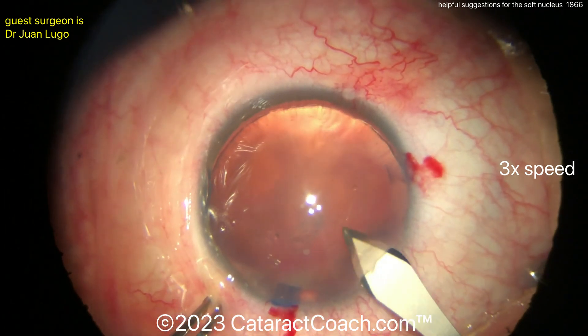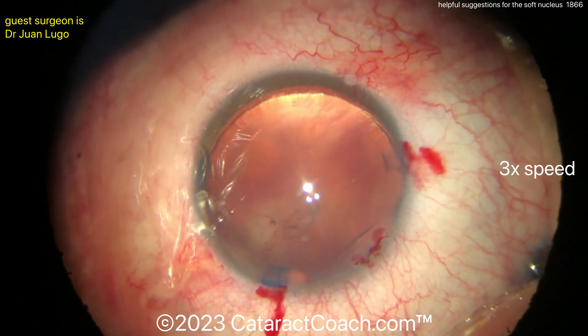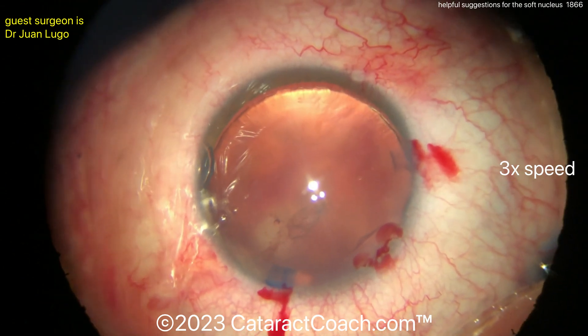Let's see the main incision — here comes the main incision. Looks pretty good. Nice limbal vessels. And time for the rhexis.